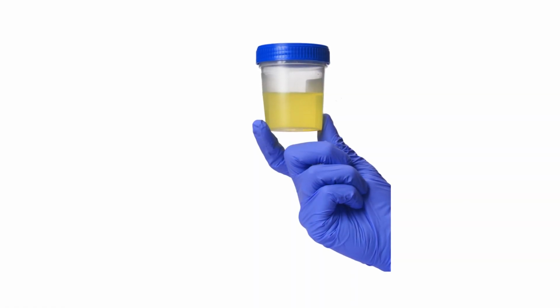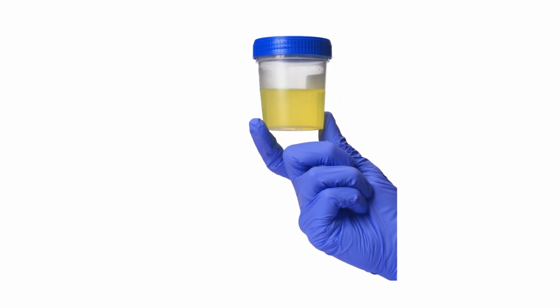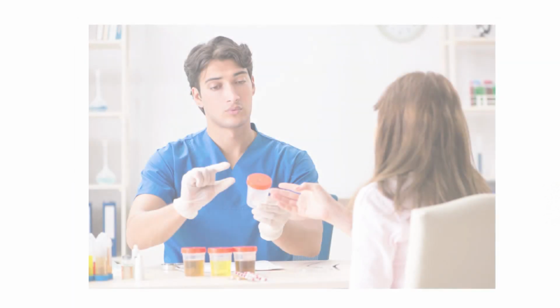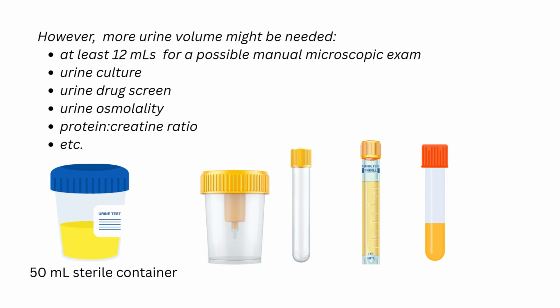Urine clarity describes the transparency, haziness, cloudiness, or turbidity of urine specimens in routine urinalysis. Ideally, we obtain a clean catch early morning specimen that we can process within 2 hours to avoid bacterial overgrowth. Automated UA instruments usually require at least 2 milliliters of urine volume.